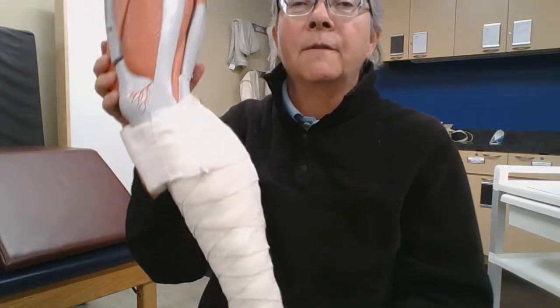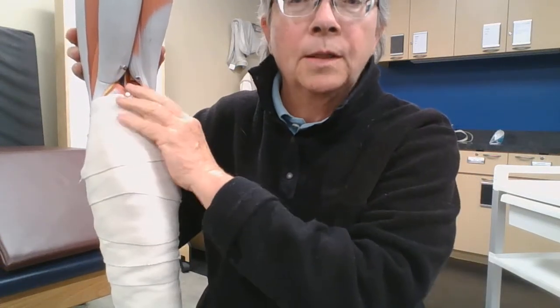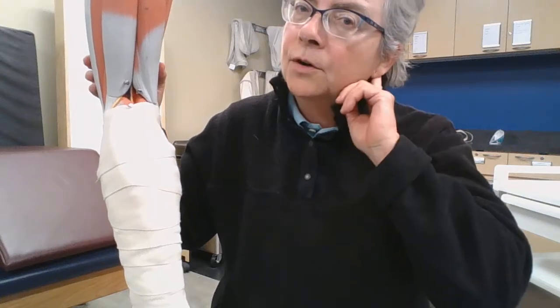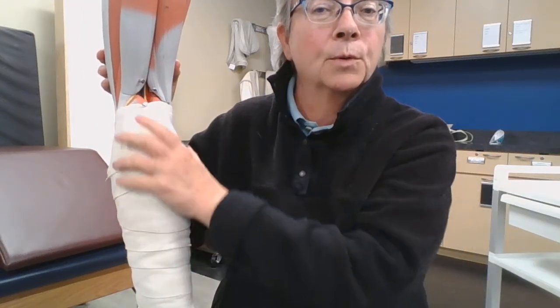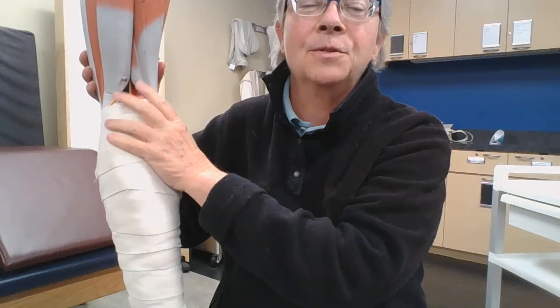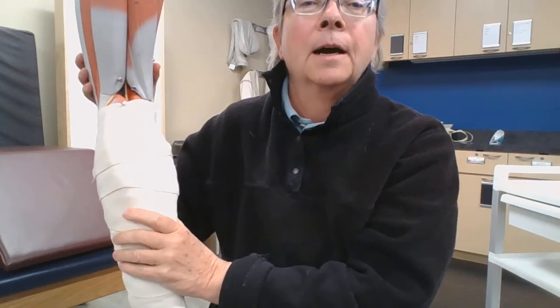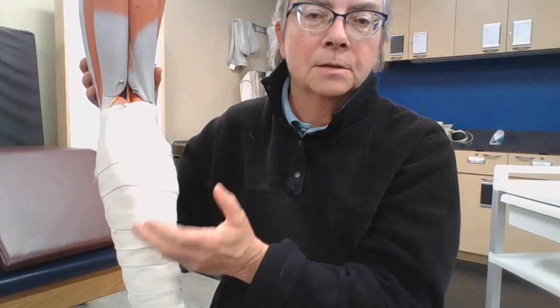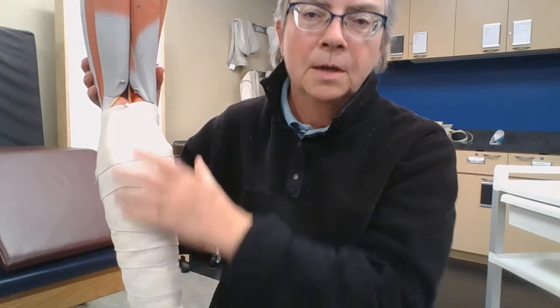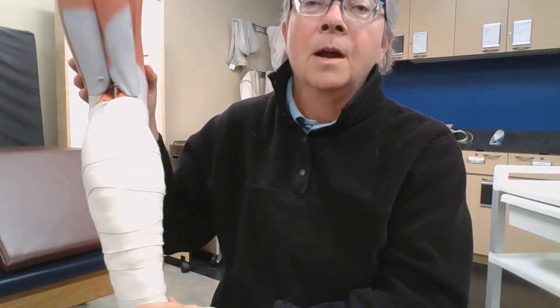The other thing we don't do, obviously, is go into the popliteal crease. If this is this patient's popliteal crease here, we don't want to go in there because we know that there are vessels there, veins, arteries, and nerves, and we don't want to compress that. We're trying to get the fluid up, and we know that the knee area is very rich in lymphatics and lymph nodes, and so we're bringing this fluid through compression, helping support the vascular system, particularly the lymphatics, which is going to bring the fluid up into the venous system, and eventually it's going to go through the subclavian and back into circulation through the heart. All right, so we end that there.